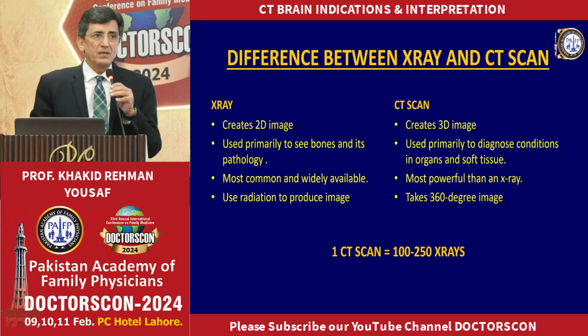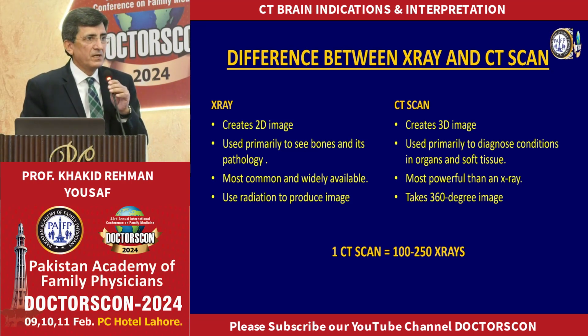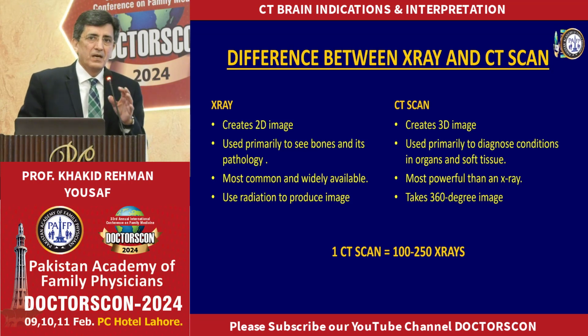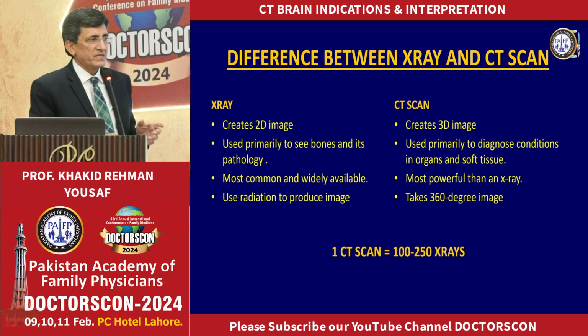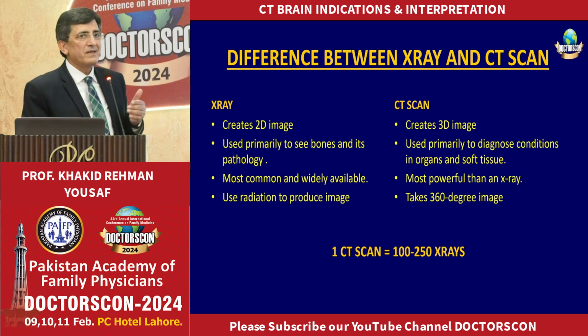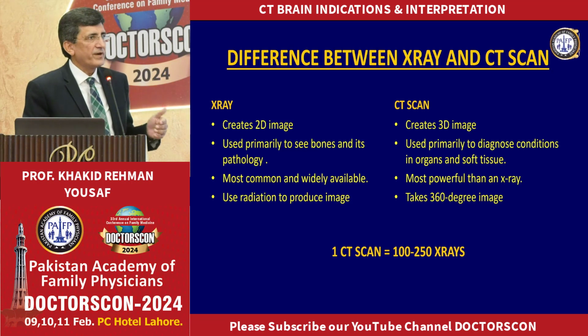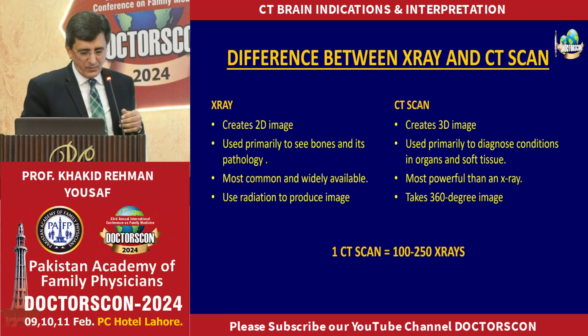That means a lot of radiation is given to the patient. So please, the patient should qualify in your clinic for a CT scan before you refer them. Otherwise, unnecessary CT scans give a lot of radiation to the patient, to their eyes, the thyroid, and other important structures.